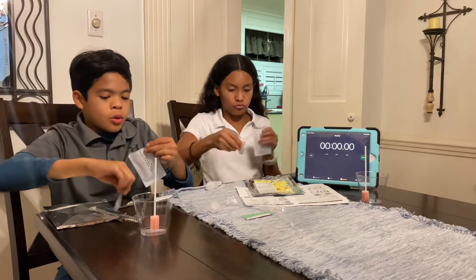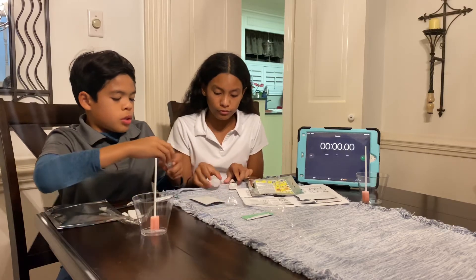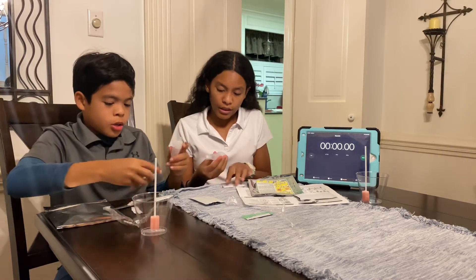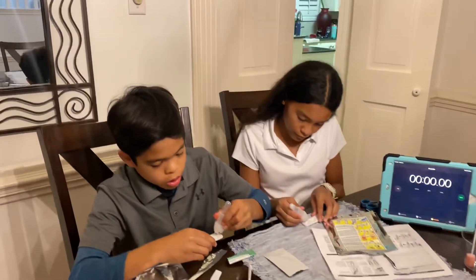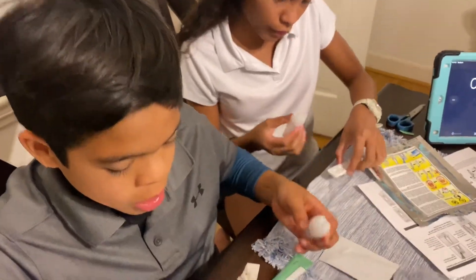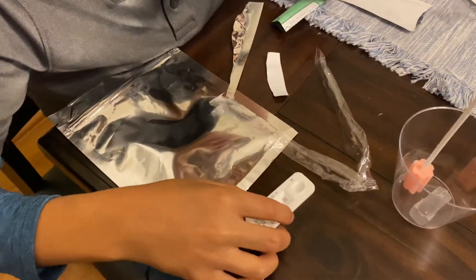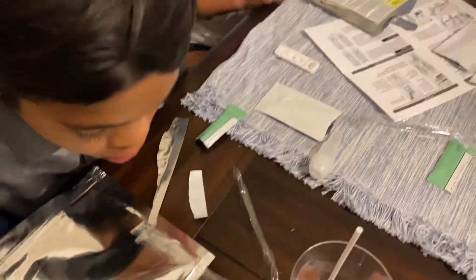Open the cassette, which will show if you are negative or positive. Lift up the little dropper — there should be a hole where the S is. Put three drops in the S. Soon you will see it rising. If there are two lines on the T and the C, you are positive. If there is one line on the C, you are negative. If nothing shows up, it's invalid. If it's in between the C and the T, that is also invalid.